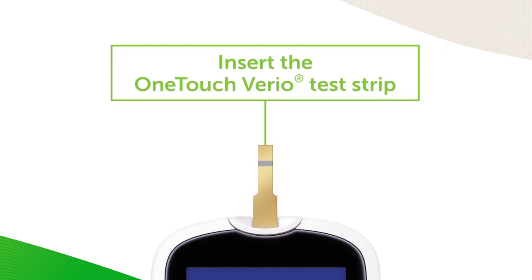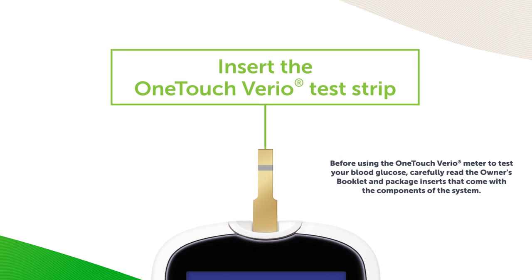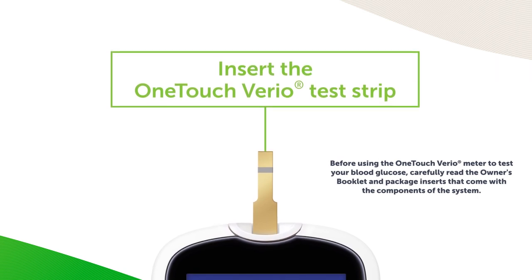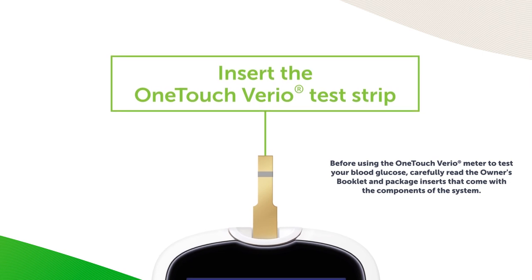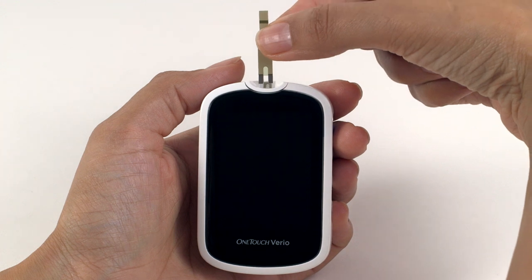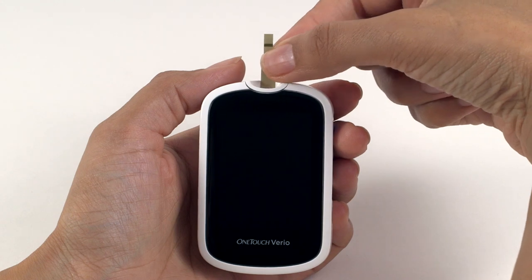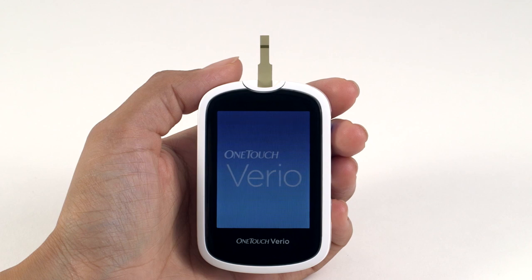OneTouch Verio test strips are for single use only. Do not open the test strip vial until you are ready to remove a test strip and perform a test. Use the test strip immediately after removing it from the vial. Tightly close the cap on the vial immediately after use to avoid contamination and damage. Now we can prepare the meter for testing. Take one of your OneTouch Verio test strips and insert it into the meter's test strip port, making sure that the gold side of the test strip and two silver prongs are facing you.